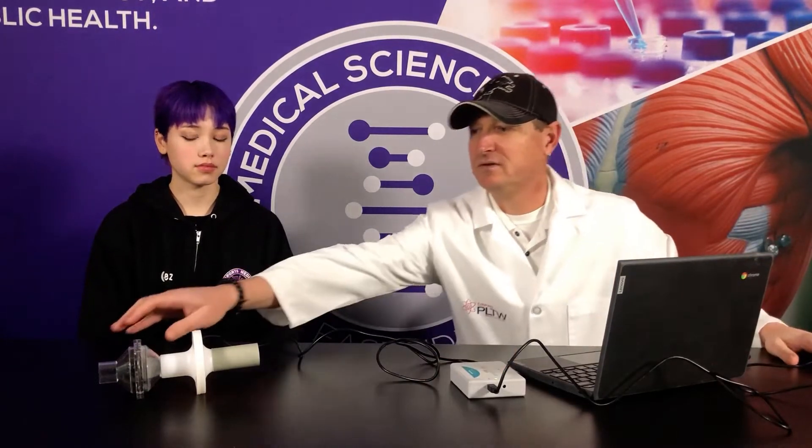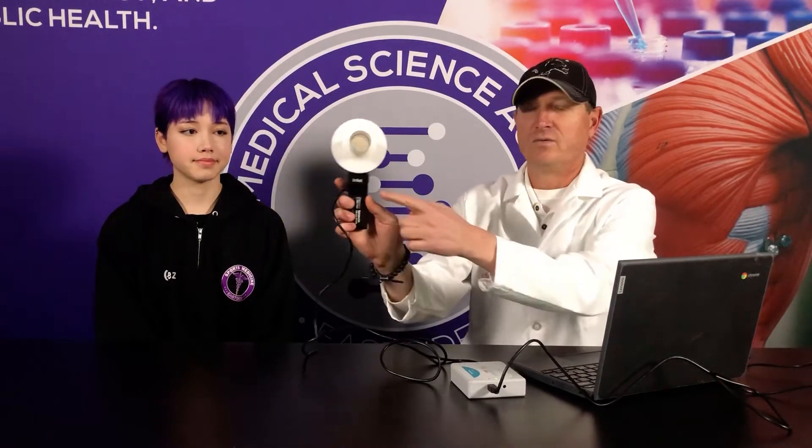First thing we're going to need is a Chromebook and a LabQuest Mini. We have our spirometer here. You can see that we have a bacterial filter and a disposable mouthpiece. This is only used by her, so that is going to make sure that she's safe. We're going to look for the inlet portion of it and she's going to breathe into that.